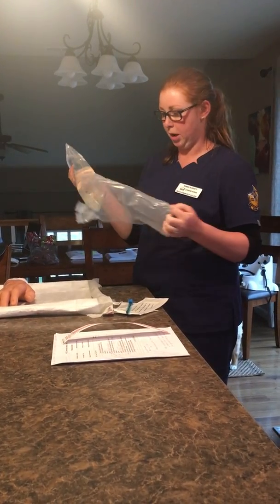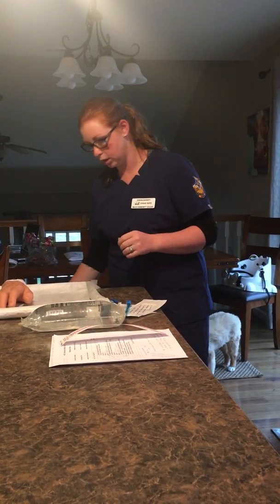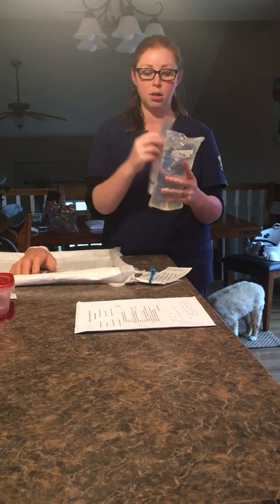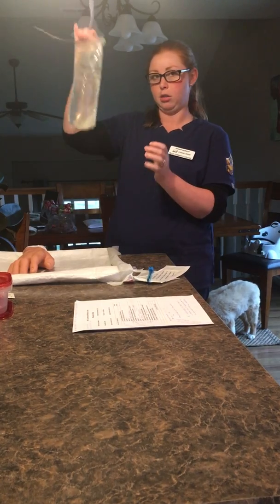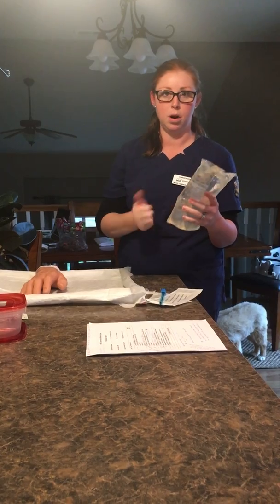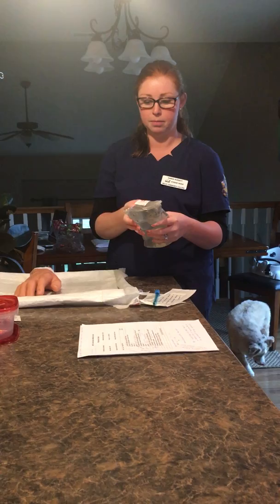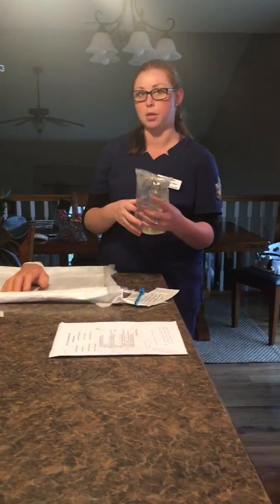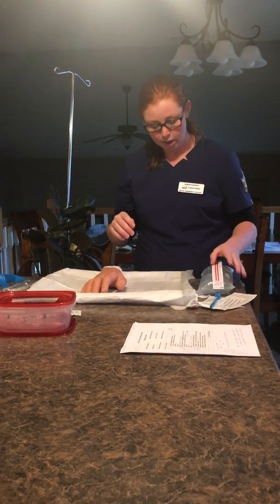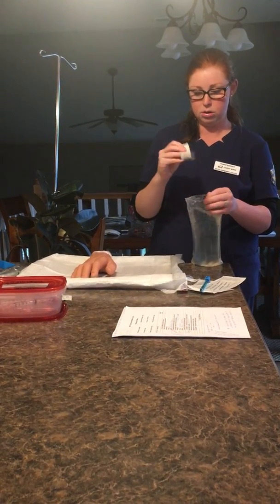Again, probably making sure the bag is intact after you get it out of its protective covering, and again looking for particulates, etc. And I'm probably not going to throw this label on there until I get it hung, so that I get it hung at the correct level. I don't know if I mentioned on this label that you're also going to want to have the patient identifier, room number, date, time, obviously that we started it, my initials, and then the lot number of the IV. So we're going to go ahead and I guess from there we can hang this.